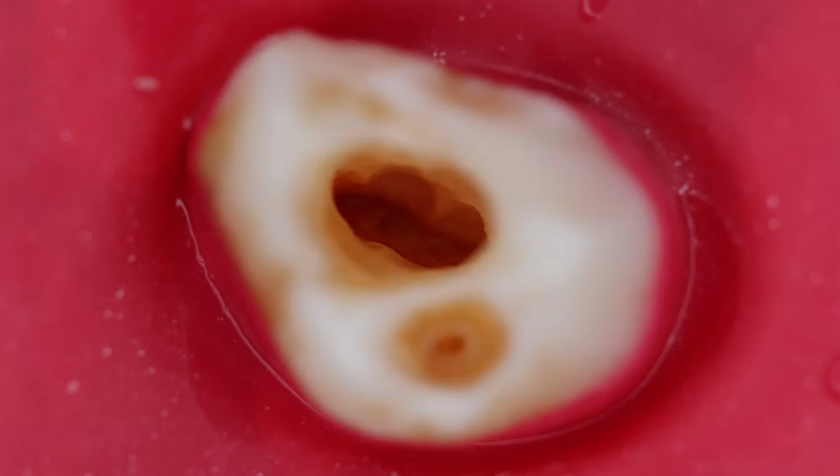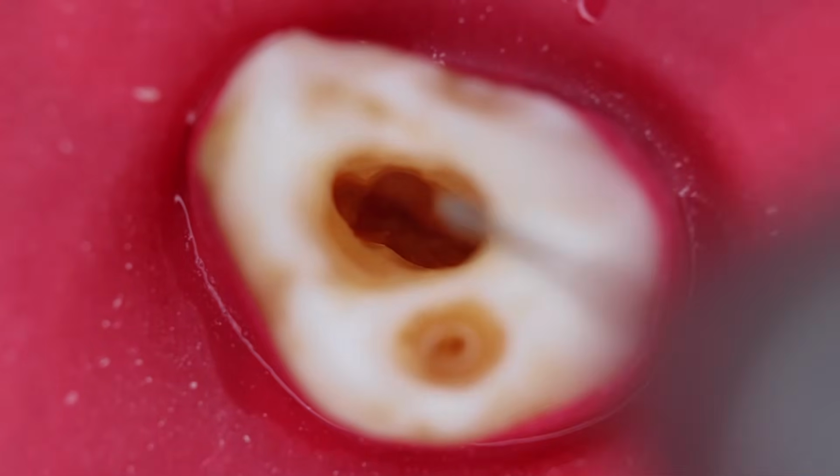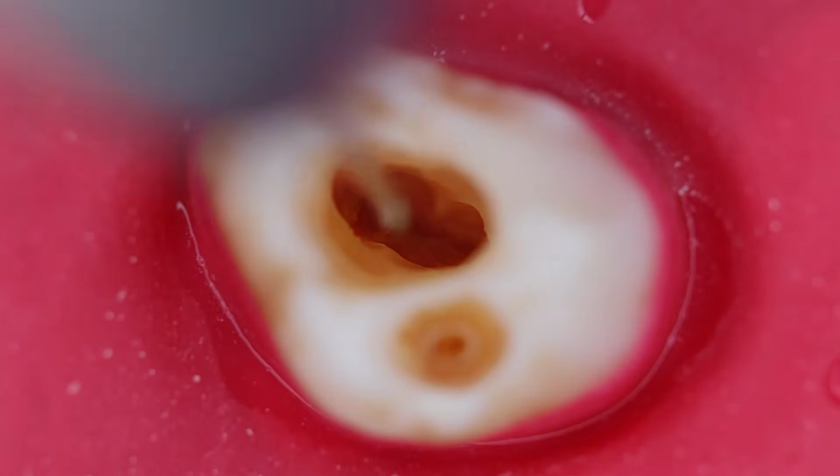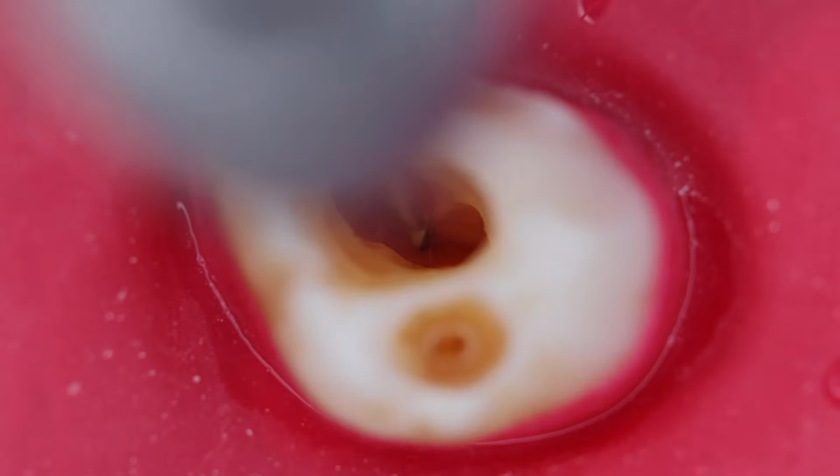So we have a comment from a doctor. Hello doctor, hope you are doing good and you are able to understand the things. If you have any queries, you can ask in the comment section. We are going very slow. Now we are enlarging the MB2 over here. Now this is done. Now let us enlarge the distobuccal canal.